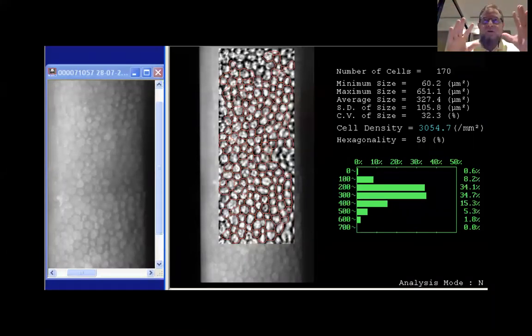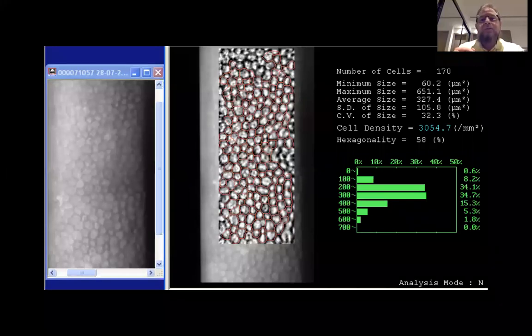Of course, these are my observations. We have to test this against people having ectasia, of course. And actually, we are carrying out a study to test this PS3, but personally, I apply it strictly. And by the way, people may think that if we apply this, we may exclude many patients. That's not true. If we know how to read the topography, if we know how to exclude factors of false positives and false negatives, then we will end up including most of the patients safely in this PS3.